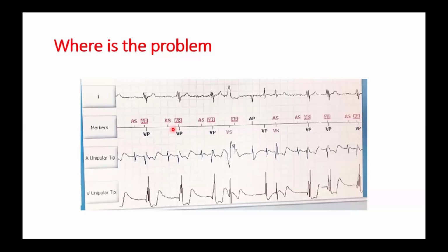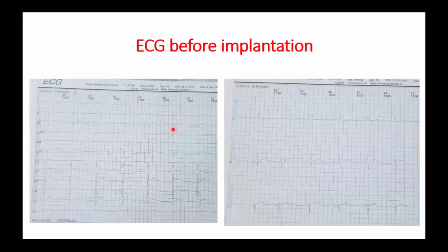This is the final case, and it is a very interesting case.